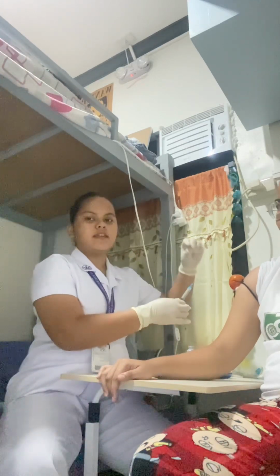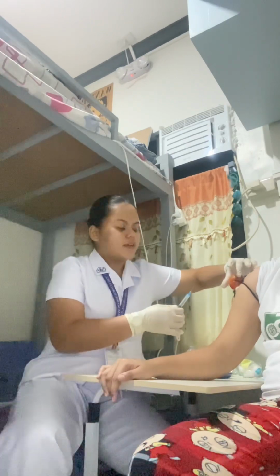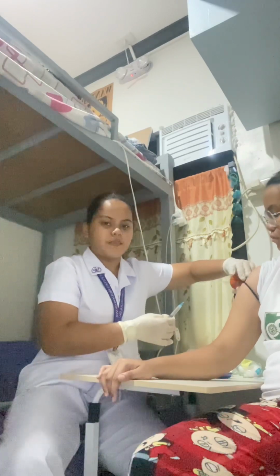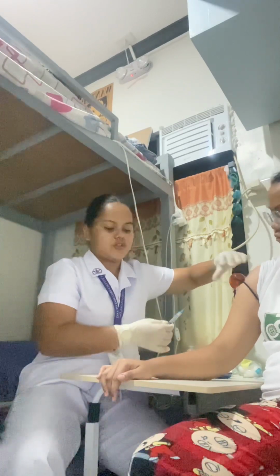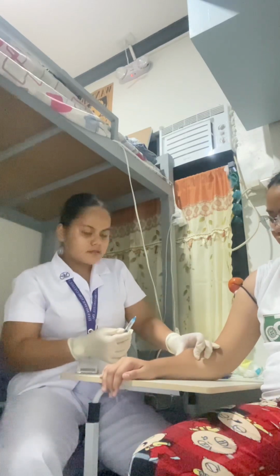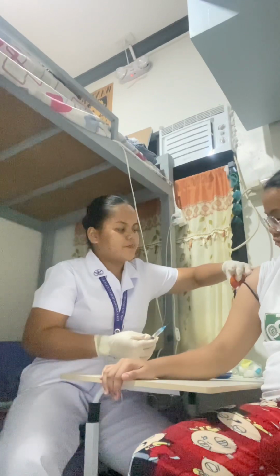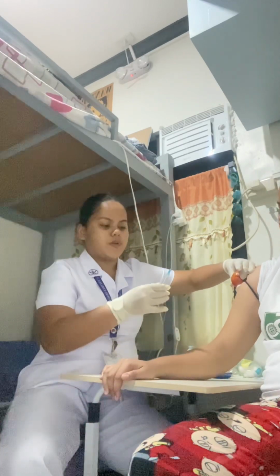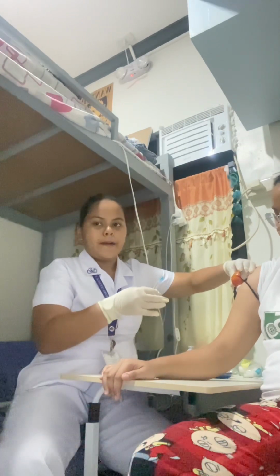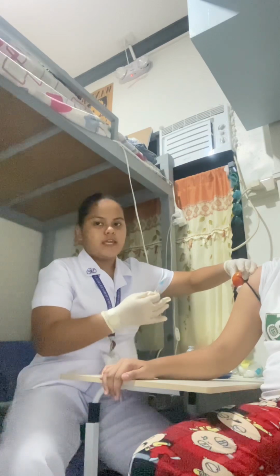In injecting, I'll be using a Z-track technique. In the Z-track technique, I'm going to pinch the skin of the patient like this, pinching it like this. I have to do it on the deltoid side. Then using my other hand, the muscle can be pinched if the client is an infant or an emaciated client.